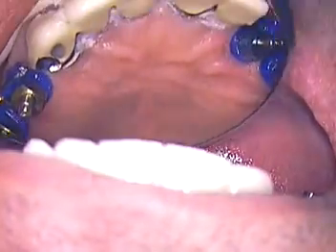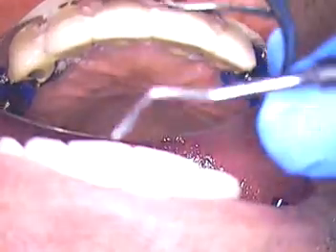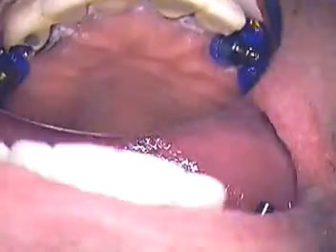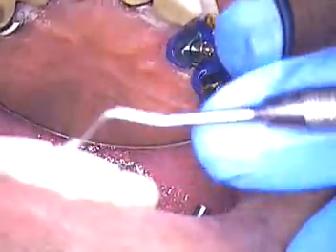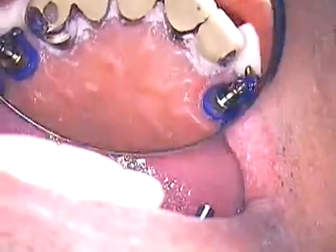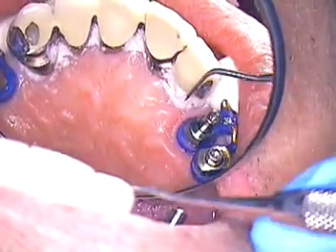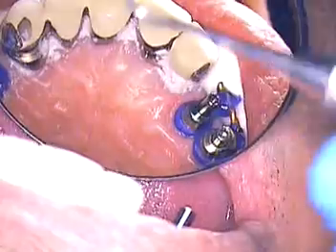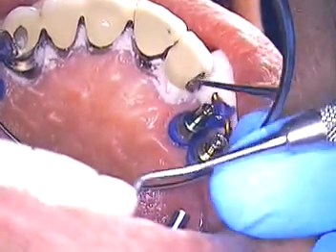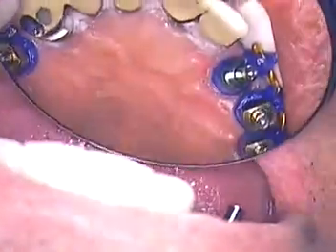This material does expand with saliva, which is nice — it fills all the little voids so we don't lock in. Now I'm going to put a little Vaseline on his own natural teeth. Clear my contacts — they look good.